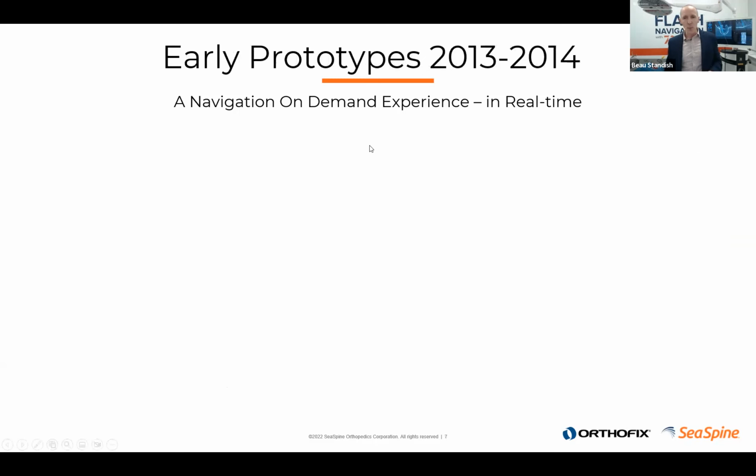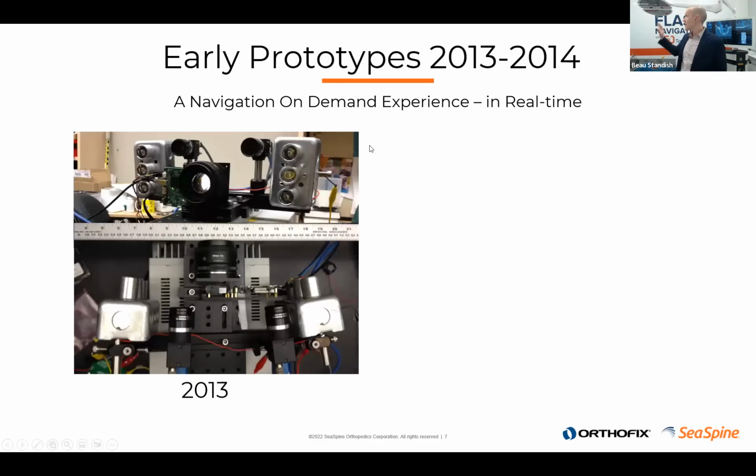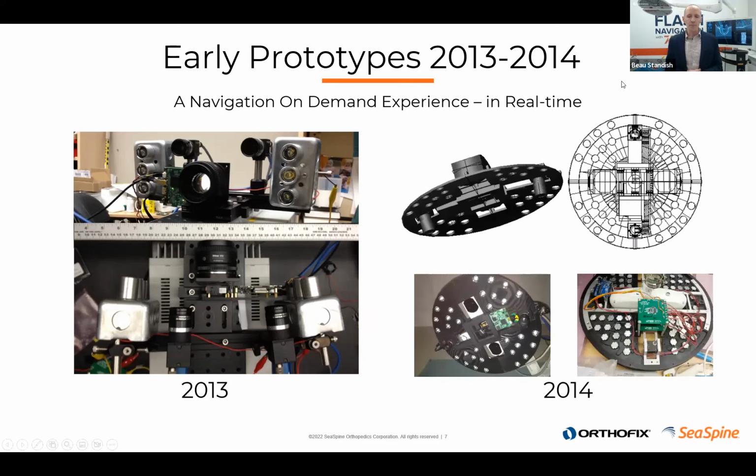Moving forward a little bit more, since we are now in the top-down look on the patient's anatomy, we're taking up OR real estate, the lights. We needed to create our own 3-dimensional, or I should say intraoperative lighting system. So here's some early images, again, off the shelf. Literally, those days, shows you how long ago it was, going to like a Radio Shack to getting some of these electronic components to create the initial synchronization boards and the optics to create those surgical lighting plus 3D imaging.